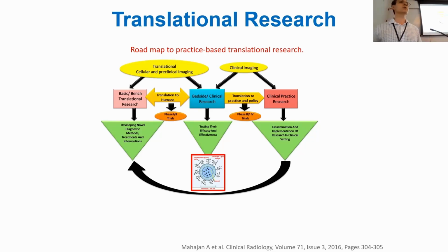You have the imaging at the clinical trial with clinical systems. You'd like to have something similar at the preclinical level. So I'd like to start, as a motivation, with this idea of bedside to benchside to bedside. If we talk about, for example, the drug, but in this context, let's talk better about nanoparticles that can be used for imaging. Some of these nanoparticles, as I show you, can be used for theranostics. In this particular case, we have a liposome that has some iodine inside.